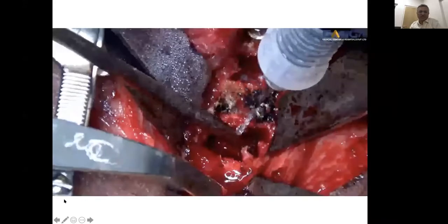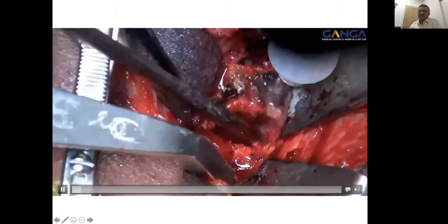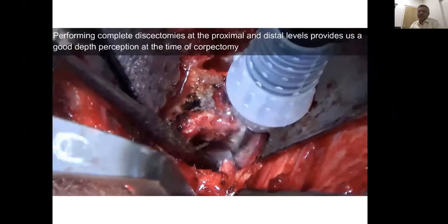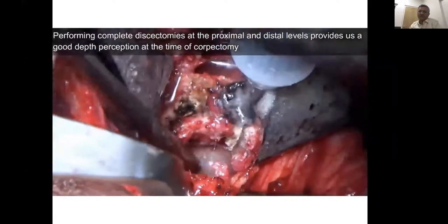I will just show the video. This is a video done by Bharat when he came to our hospital, and I'll show the way he has done this particular procedure. Basically, he has done the discectomy above and below. This is a corpectomy video. As you can see now, he's going with a forward movement.